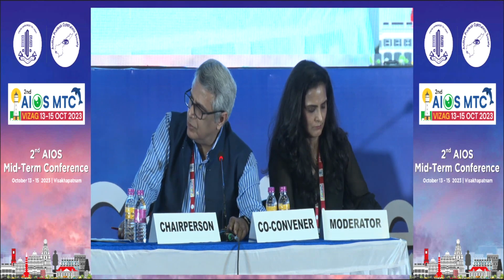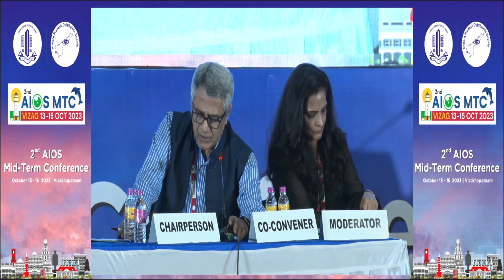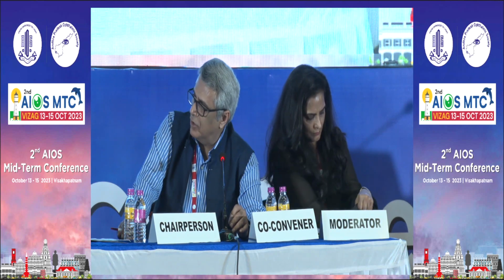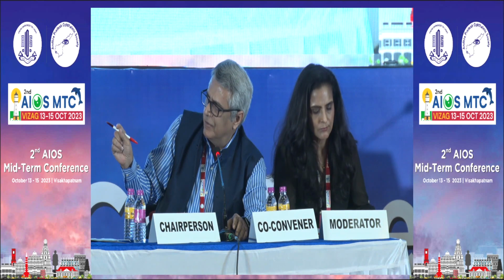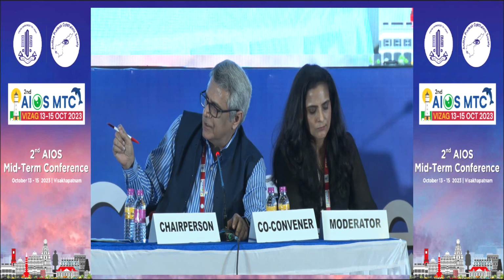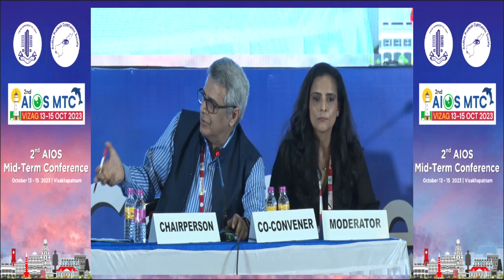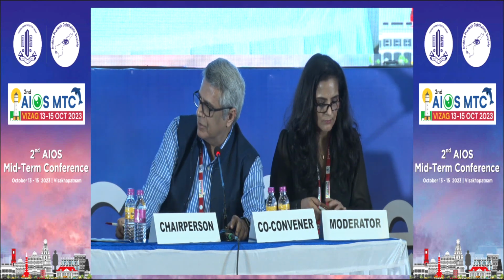A couple of questions always remain with this high technology tool. There is a lot of fascination in using this, but taking it into everyday practice, specifically, you talked about abnormal and normal. A lot of times we discover those silent CNVMs, which are picked up. But do you treat them, or do you just observe them? So observe them. The endpoint is not known, even in routine CNVMs also.